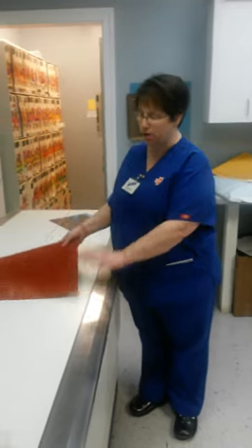Hey, this is Kate from the Monroe office. I'm going to show you how to make a copy of an x-ray film.